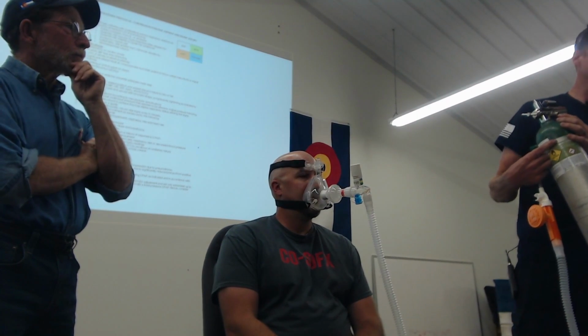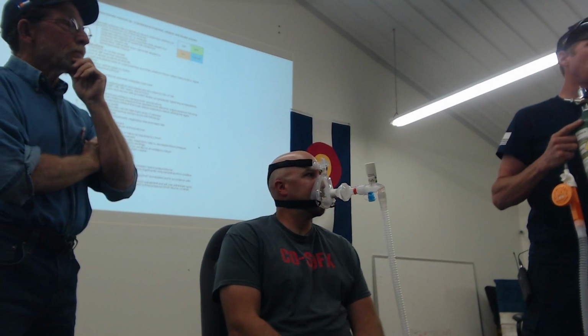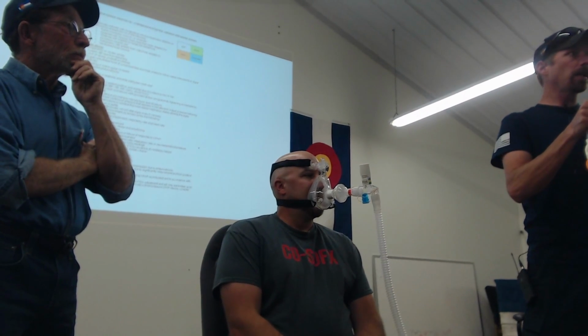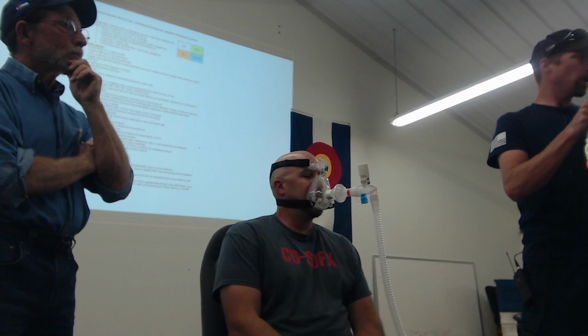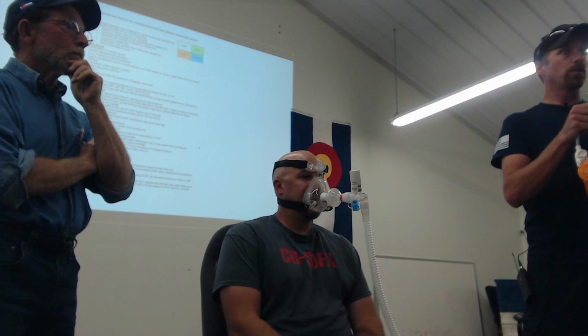These high pressure ports, if you look in the bottom of them, have a little gold or silver piece that's poking out there. That's actually a valve. So as soon as you start to screw this in there, it's actually going to push on that valve and start to release the air. So unlike the regulated port where you actually adjust the flow, these are set. They are going to release the full pressure.